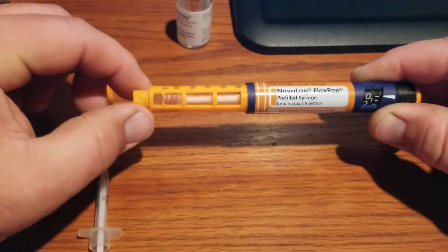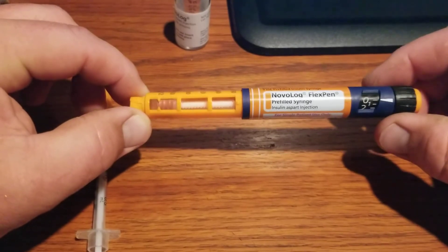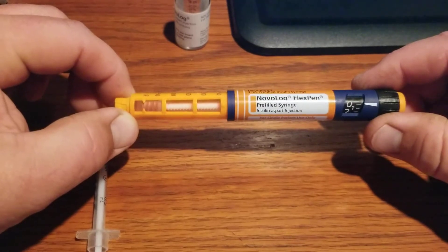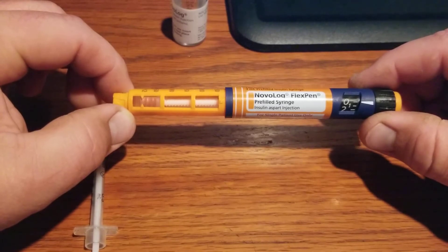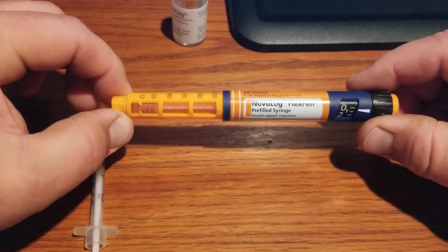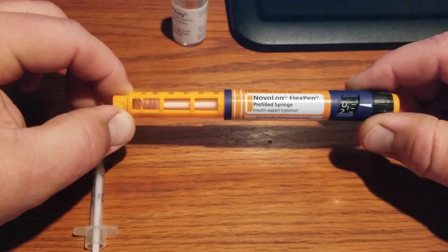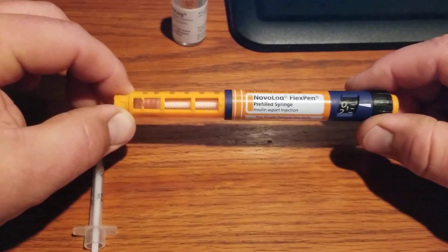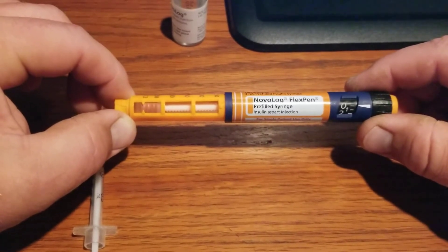This is also a video on how to draw insulin out of an insulin pen. I don't have insurance and these fast-acting insulins work a lot better for me than the insulin you can buy over-the-counter at Walmart cheap. These are really expensive, and occasionally someone who goes off a certain type of insulin gives me this stuff. I'll use it up because it works a lot faster than regular insulin, although unit for unit it's the same thing.